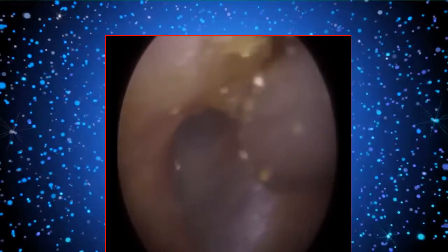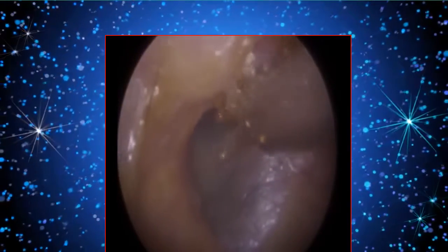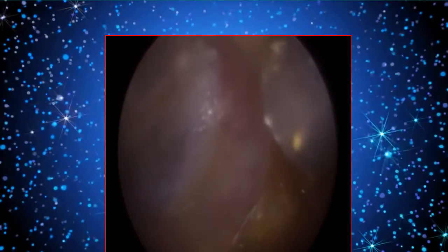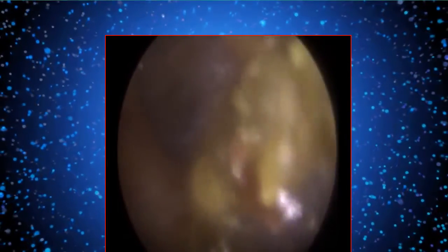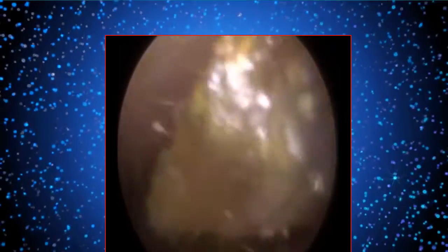So just delicately as possible, just hovering over the canal wall. Again, if you've been watching my videos, you'll be fully aware that we've got to be very careful with the inner two thirds of the ear canal. The outer third, what we call the lateral aspect, is made up of cartilage, and you've got a layer of fatty tissue that cushions against the bone of the ear canal. The inner two thirds don't have any cartilage or fatty tissue, so it's literally a very thin sheet of skin coating the bony canal wall. If you do make contact with the bony part of the ear canal wall, it can be very sensitive, uncomfortable and painful for the client.